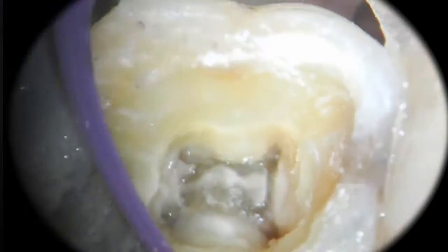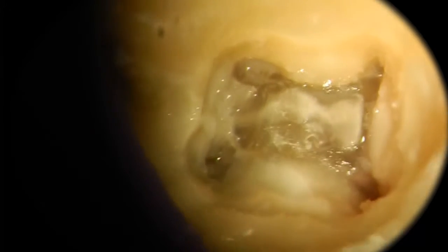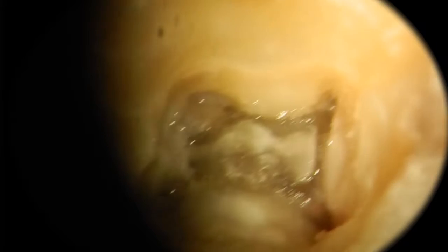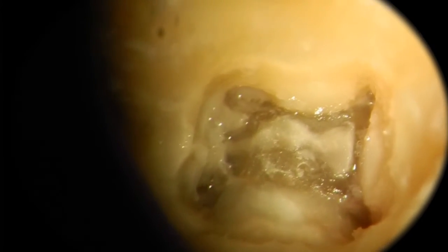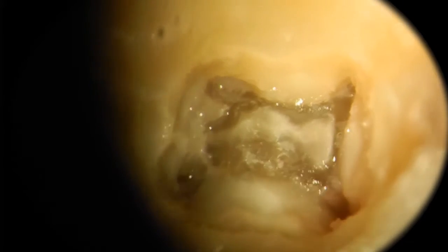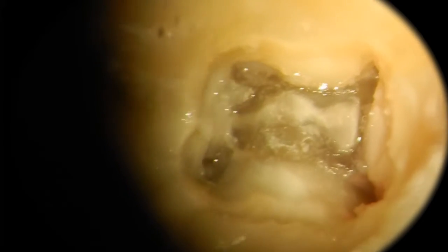I often will work in the 1.5 range, which is right here. The color still stays good, and I can see, I save, shall I say, I do most of my orifice and canal exploration at this magnification.